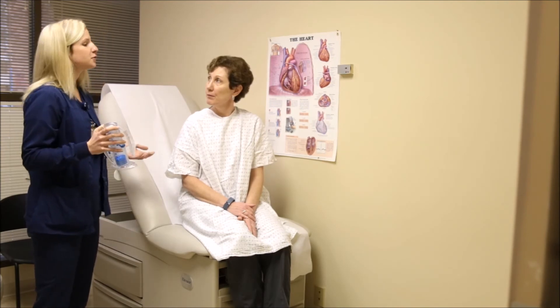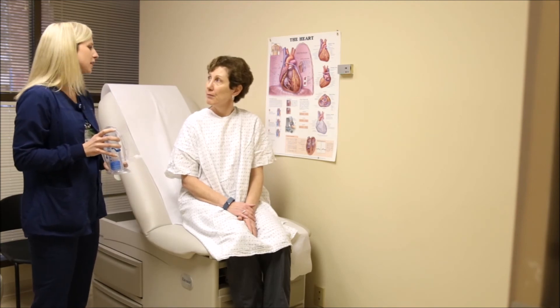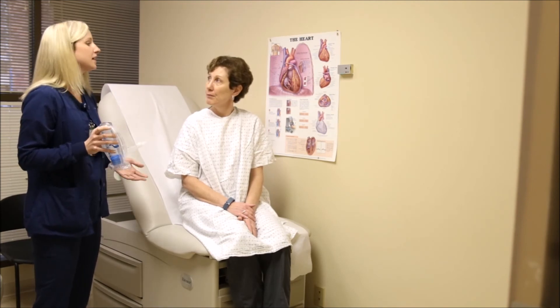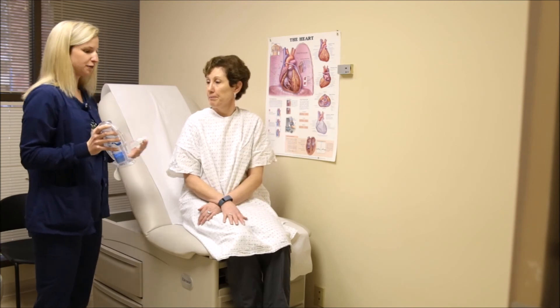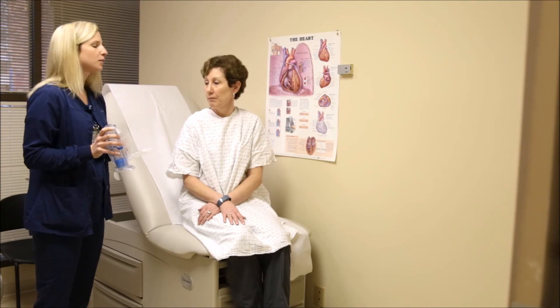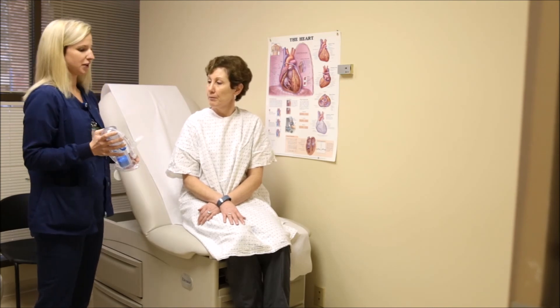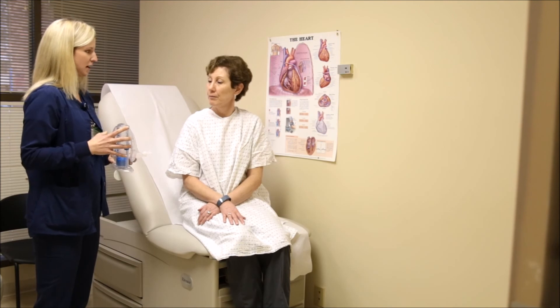If you do it maybe seven times and you start to feel short of breath, dizzy, or lightheaded, it's okay to stop. Don't feel like you need to get to 10 if you start to fall below where you're normally getting, or don't feel like you need to do it 10 times back to back.